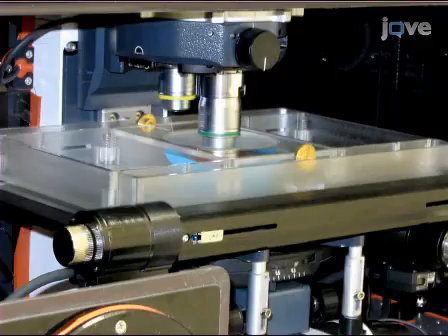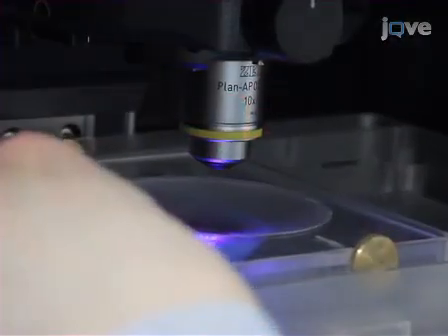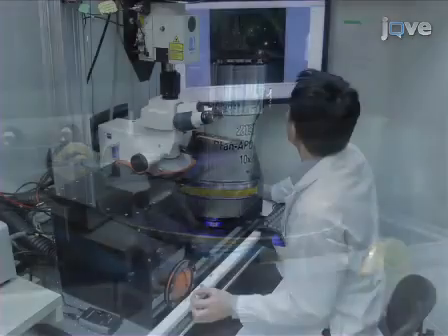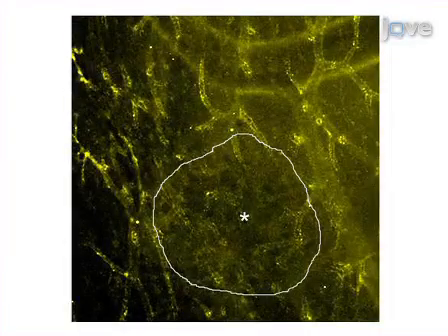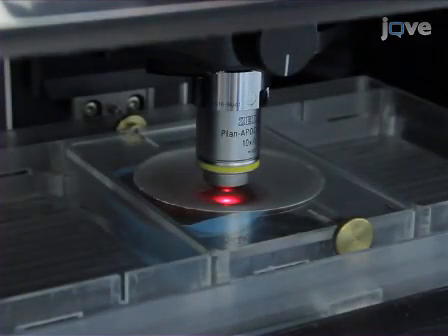At the spinning disc confocal fluorescence microscope, check that the environmental chamber is 37 degrees Celsius. Now, position the imaging unit on the stage so that the cover slip window is directly underneath the microscope objective, and proceed with imaging. Acquire high-resolution image stacks of the tumor and surrounding vasculature immediately after the injection and at hourly intervals thereafter. Images will reflect detailed structural changes occurring in the tumor vasculature. The embryo may be imaged continuously for up to 36 hours with no need to change the water bath.